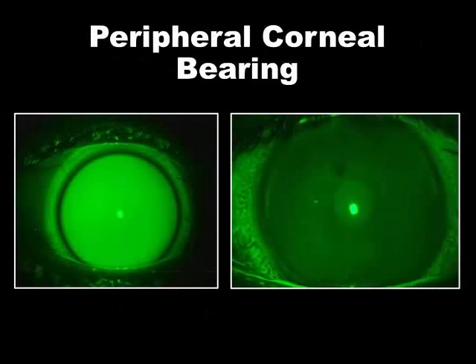Now here's why the smaller diameter lenses can be a concern. When we have this high elevation in the surface of the peripheral cornea or limbus, and this happens on patients with high scleral angles, they're effectively higher depth anterior chambers, then you may need a different lens design. Notice how this lens has this ring of bearing, or it's certainly very thin fluid there. Post-removal, you get the staining of the peripheral cornea.